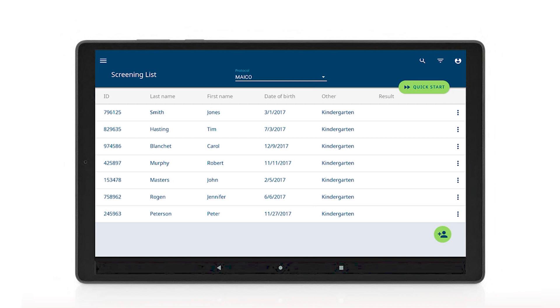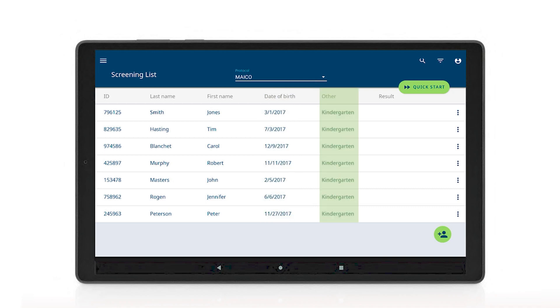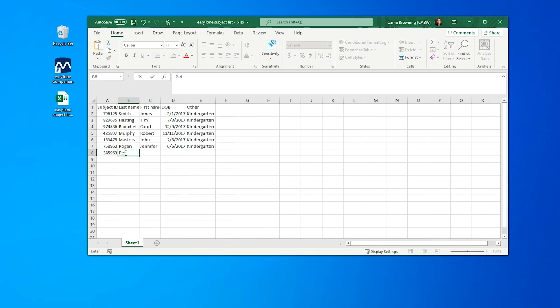The EZTONE app has the option of five columns to be imported for the EZTONE screening list and other field, which is used for any general information such as grade, teacher name, or school name. The list of subjects can be created in an Excel or CSV document.